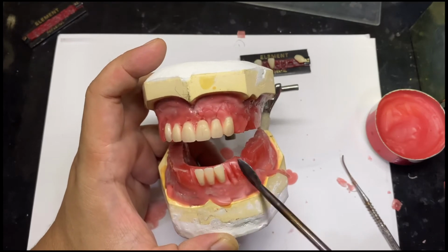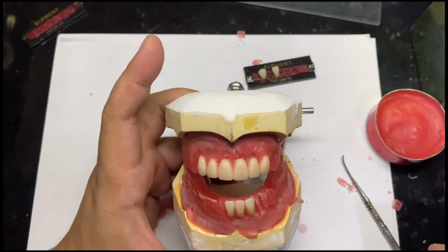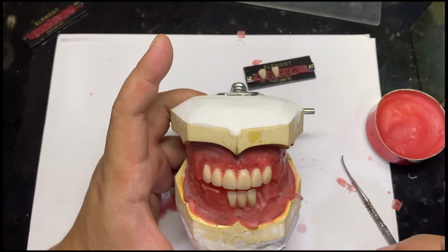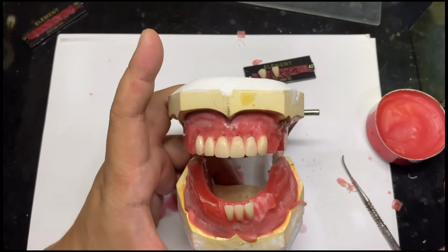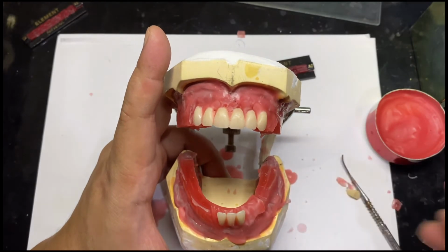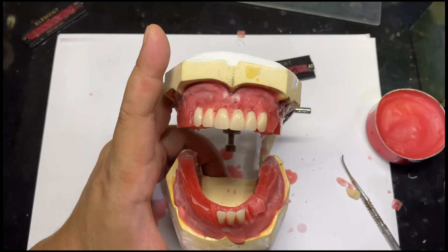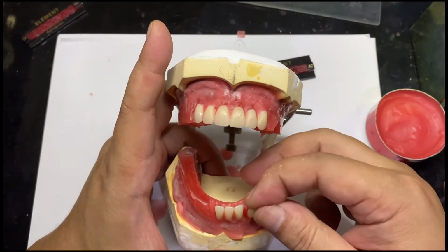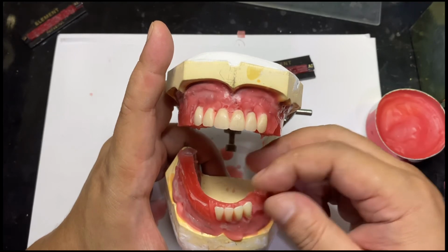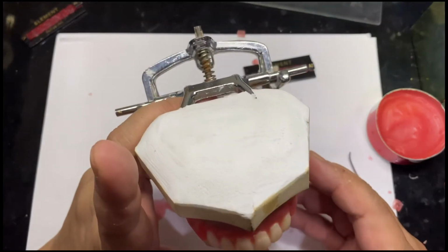Now this is the critical part, setting the lower canine. Take note that we are following the neutral zone. The distal surface of the lower canine follows the neutral zone. Again, soften. It's really hard to set artificial teeth if the wax is hard, so you have to make sure that the wax is really soft.